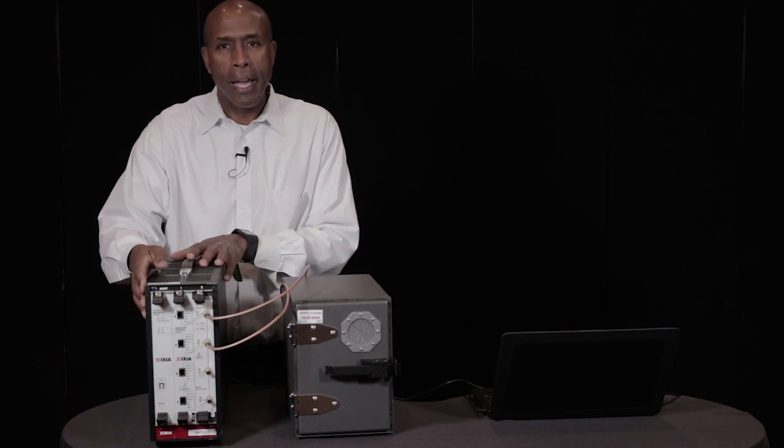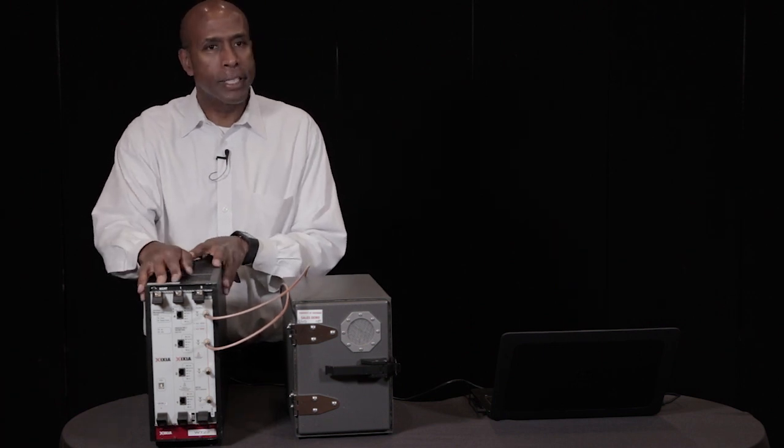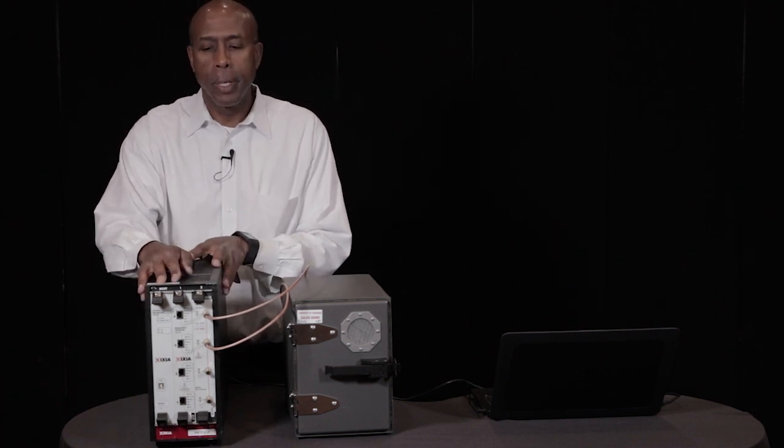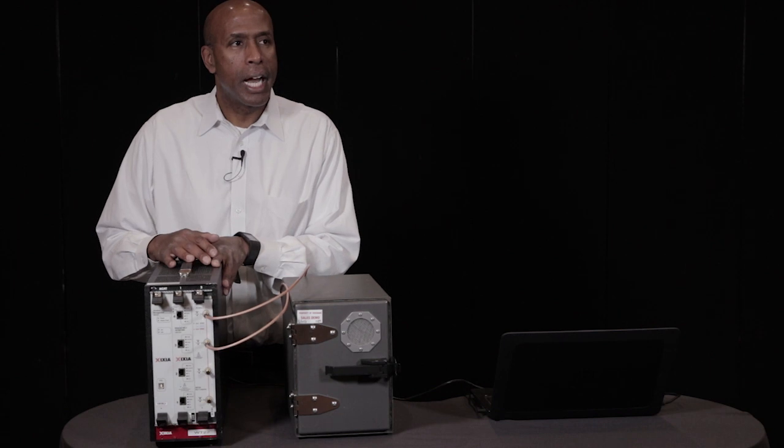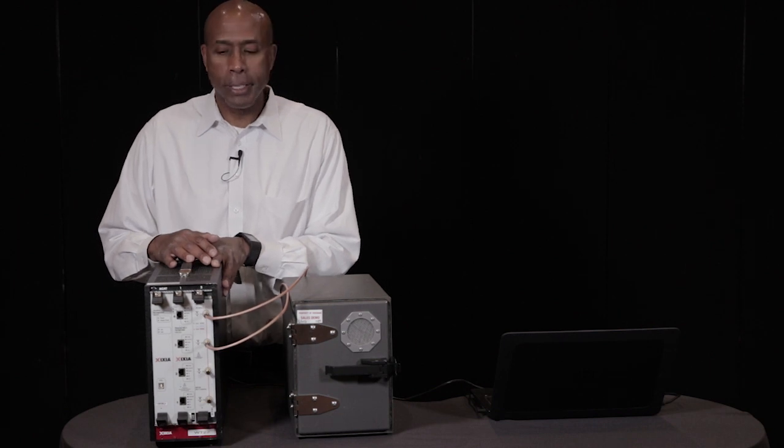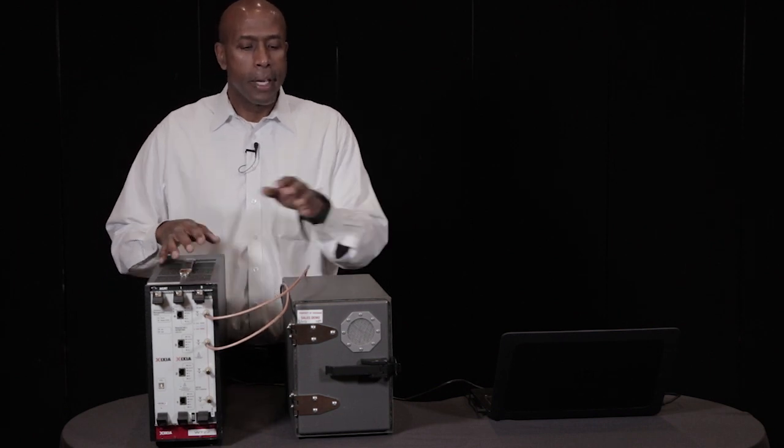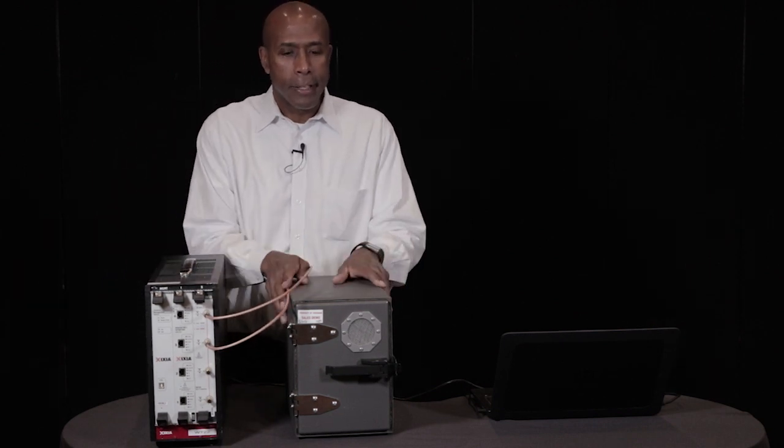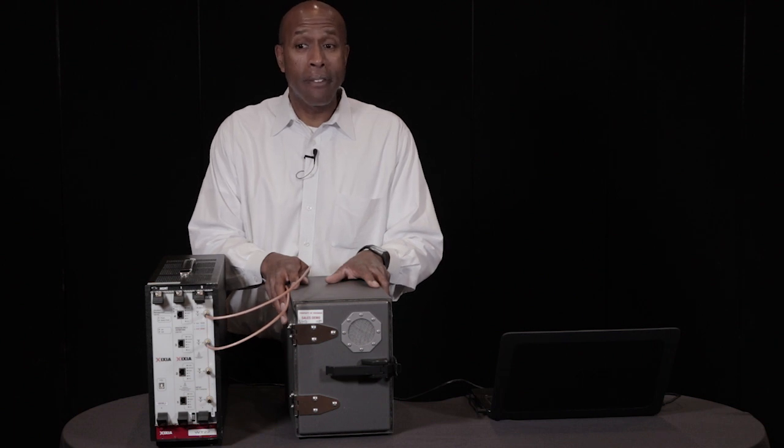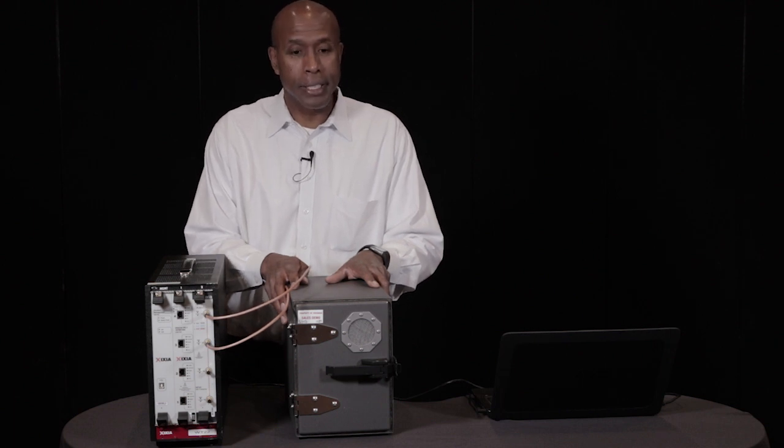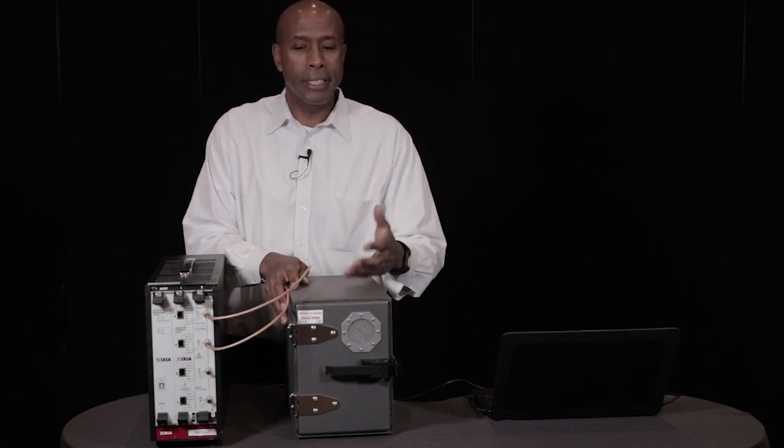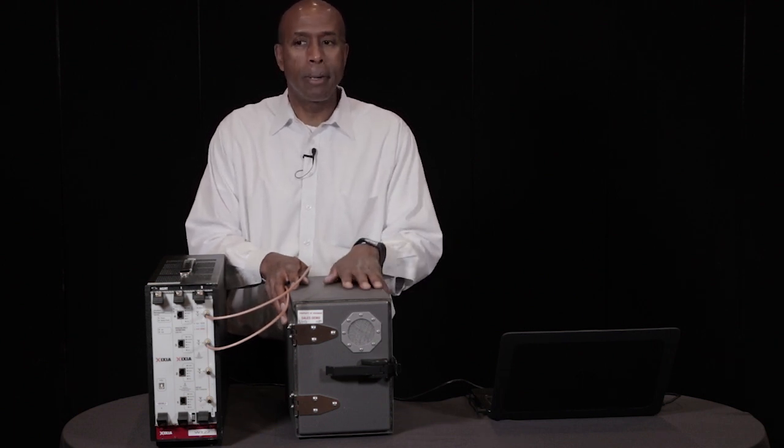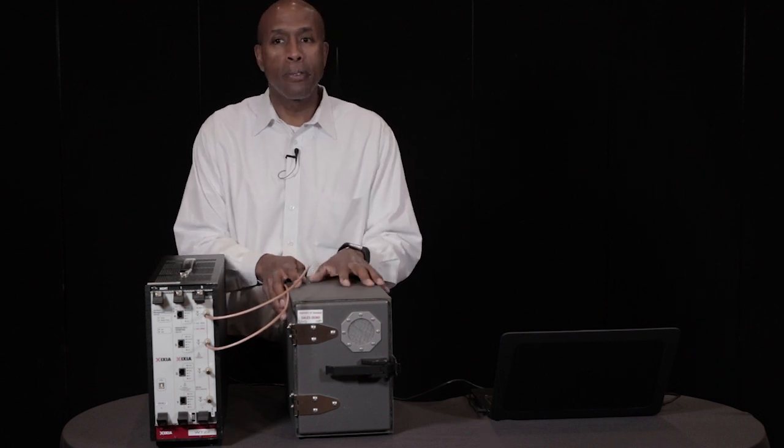We have the wave test system. This is the wave test 22 which provides simulation of access points as well as clients. This is a chamber which provides Wi-Fi isolation. We put the medical device in this chamber and then we're able to measure performance.